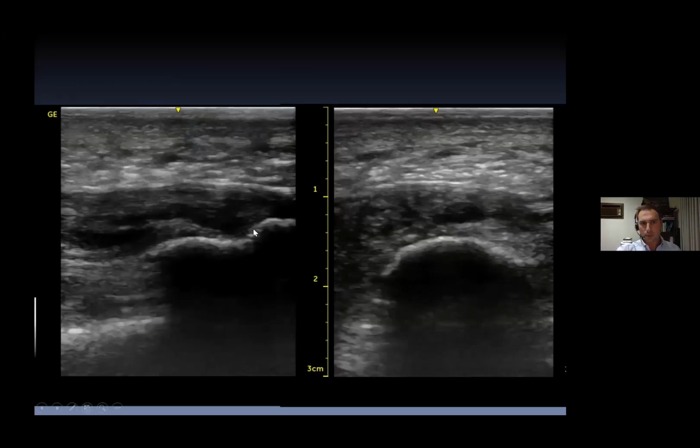So we've got part of the medial tuberosity of the calcaneus, and this shelf of bone here is the heel spur that's developed. What I get frustrated with is you'll have academics say that the heel spur is not the cause of pain, and I completely agree it's not the cause of pain, but it's also not irrelevant. I will tell you, in doing hundreds of thousands of heel ultrasounds.